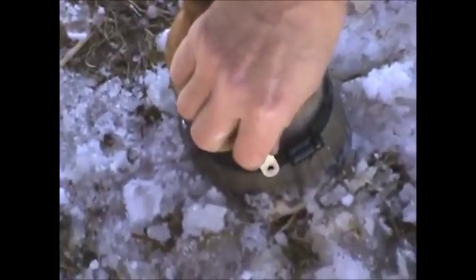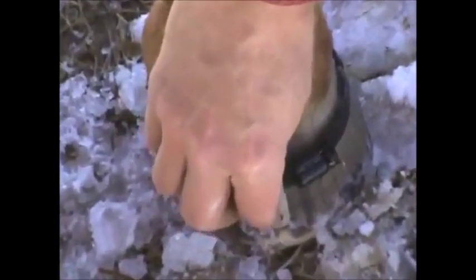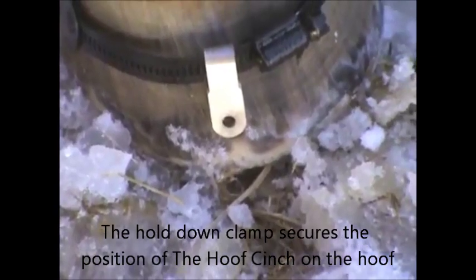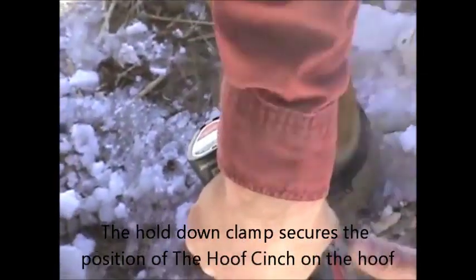The hold-down clamp we just bend over — just bend it in half so the holes line up. Slide it over. It doesn't really matter which side; I try to go opposite of the screw side when I normally do it. This will hold the band in place and we'll put the rest of the screws in and then tighten the band.